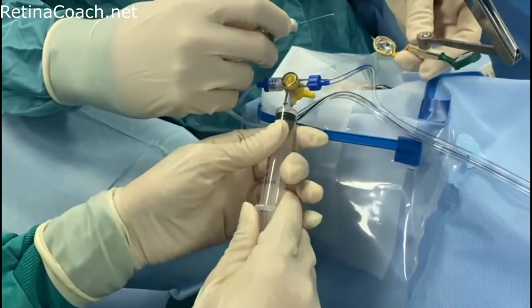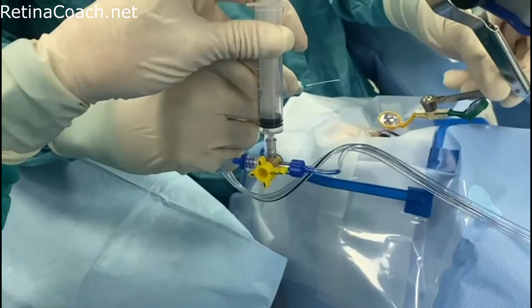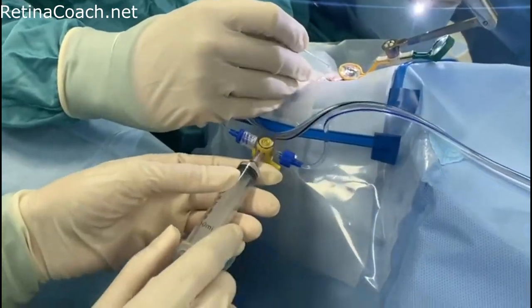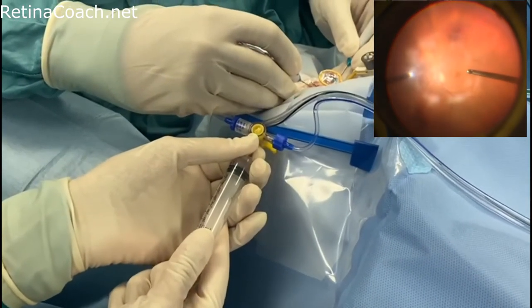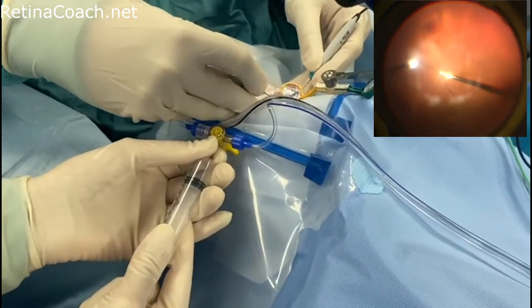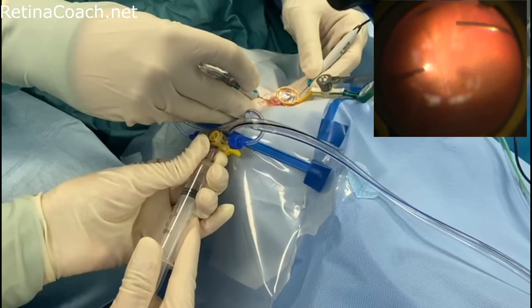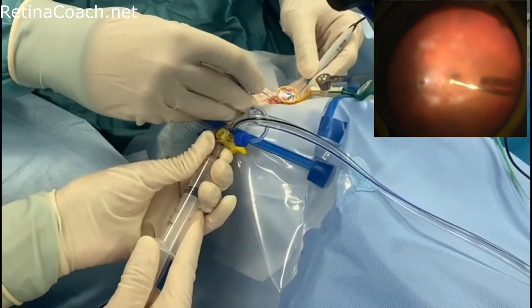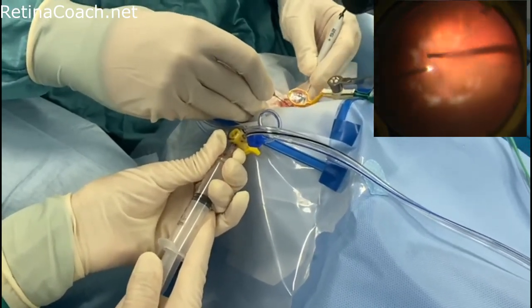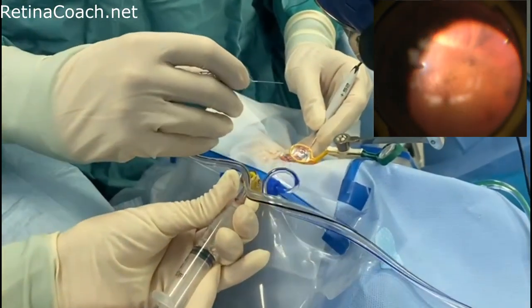Here is the same case of diagnostic vitrectomy from the assistant's view. The assistant shows that the valve is turned with off towards the aspiration line, meaning vacuum will be created by the syringe. Collection of the undiluted sample starts with the infusion system closed. The assistant pulls the plunger to create vacuum in the syringe while the surgeon performs vitrectomy and monitors the choroidals. You can see the vitreous sample coming into the syringe. When the choroidals are observed, the surgeon removes the vitrector and the assistant continues to create vacuum, allowing all the vitreous sample from the vitrector to flow into the syringe.